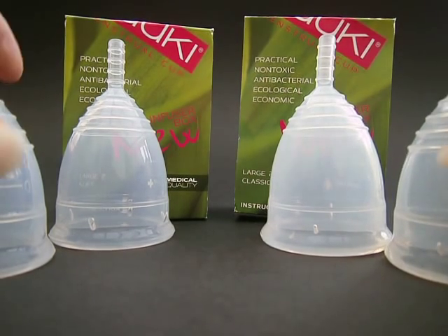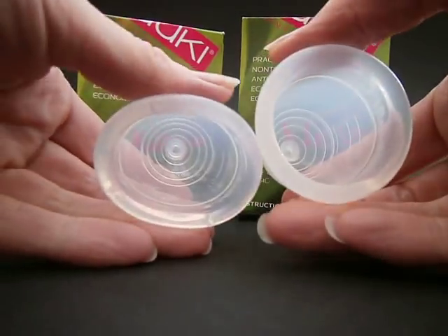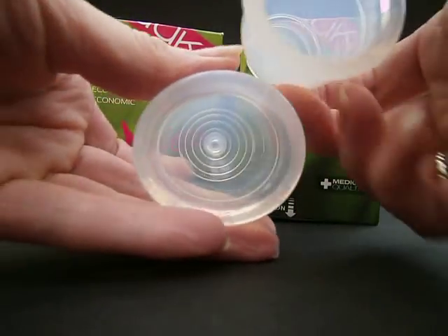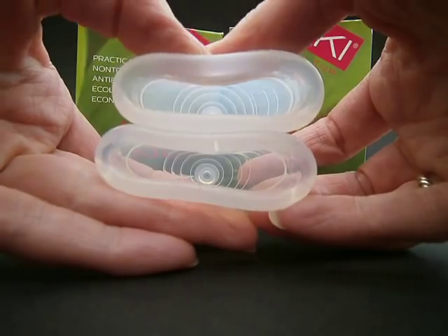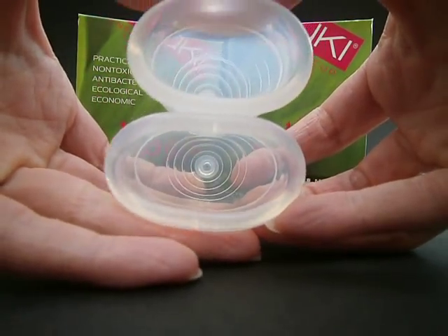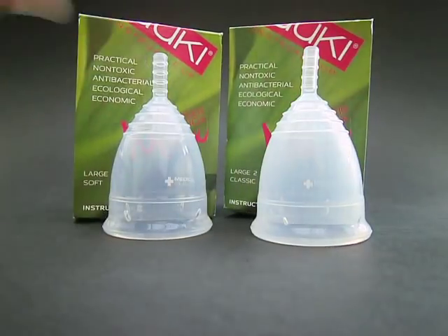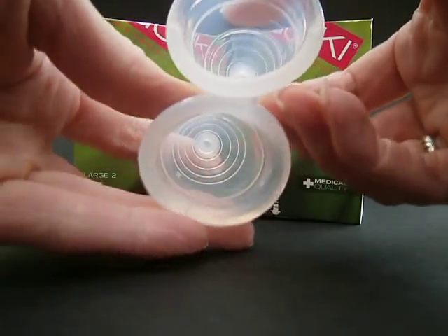I'll just show you the difference in the softness between the two different styles. This is soft and this is the classic. That was the large and this is the small — soft here, classic on the top.